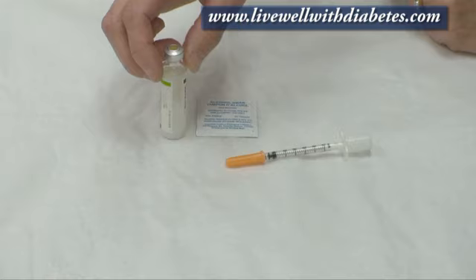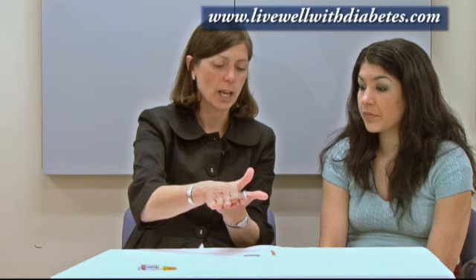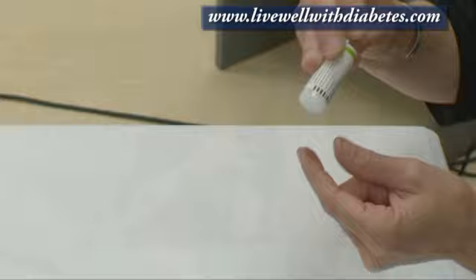Next, I'd like to show how to use a syringe with a vial of insulin. Vials may hold different kinds of insulin. This particular insulin is cloudy, so before measuring I'm going to mix it first. The best way is to roll the insulin back and forth in your hands. Avoid shaking it, because shaking creates air bubbles and makes it harder to measure the dose. You know it's sufficiently mixed when you look at the glass tube and it's all milky with no lumps on the bottom and a consistent color throughout.